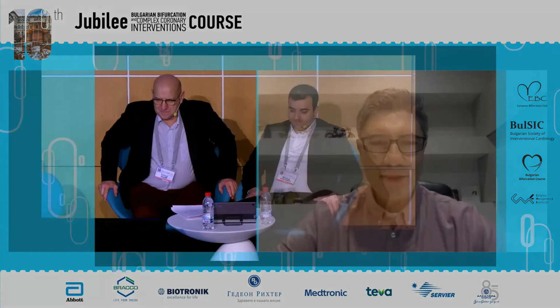I couldn't add more to this, but maybe to stress something that Dr. Piroth also mentioned: you have to be really, really careful when you take out the jail wire. It's not only the dissection that you might provoke, it's also longitudinal deformation, because of the hardware that you implant.